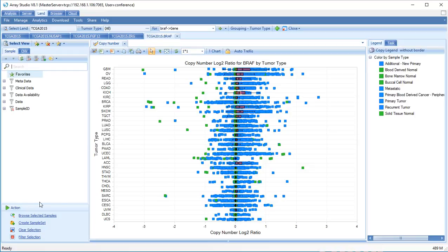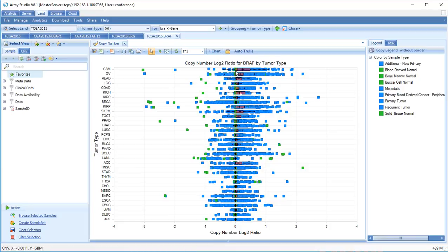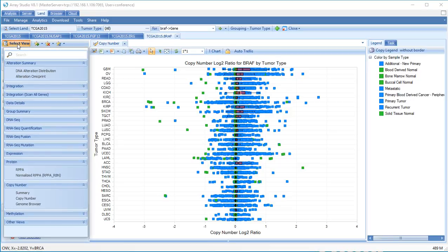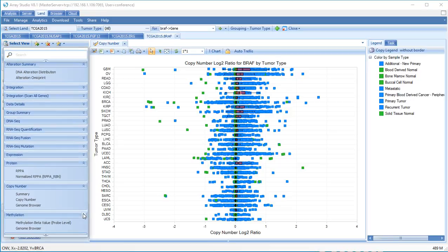As expected, most normal samples have a log2 ratio of 0. Finally, methylation data can be viewed for a given gene, summarized by probe location or in the genome browser.